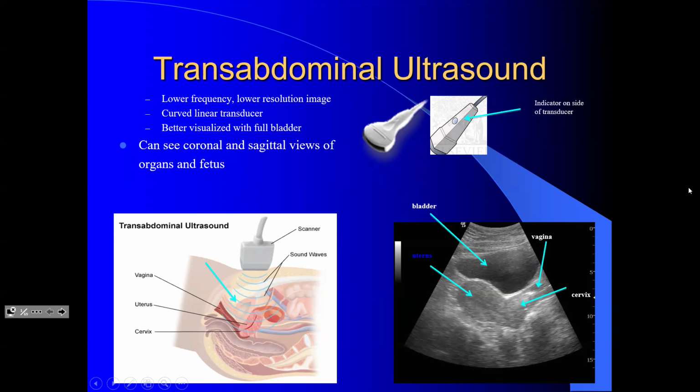Okay, so Bismillahirrahmanirrahim. We have two lectures. We'll be just continuing after this pregnancy. This is the lecture related to pregnancy, and then we talk about the breast imaging. So we covered this last time, if you remember. We said we use ultrasound as an imaging modality when it comes to evaluating the female genital organs.